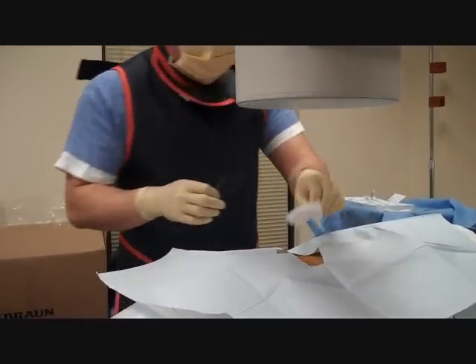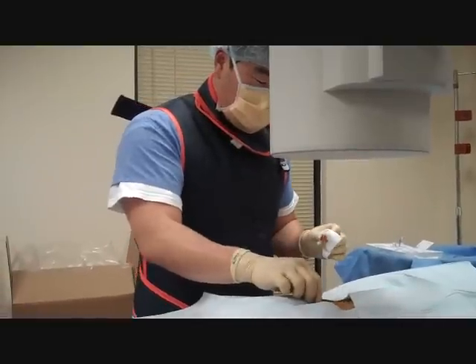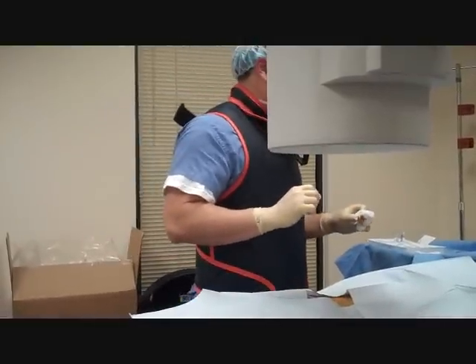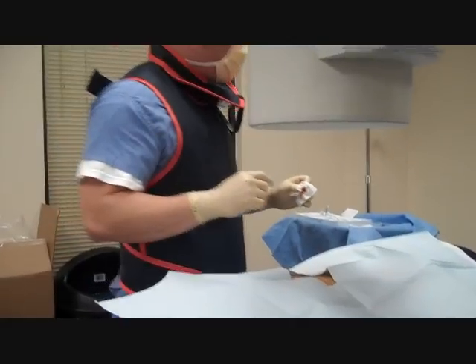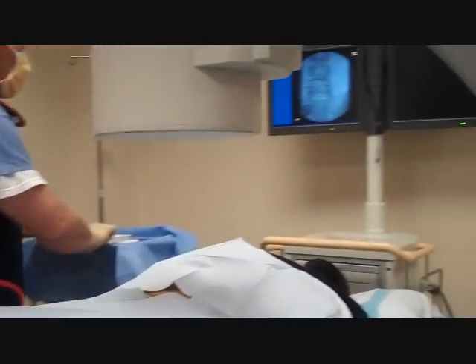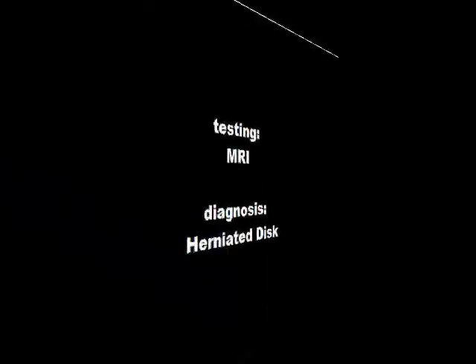Initially, we've cleaned and prepped the whole area sterilely, put a little betadine antiseptic cleaning solution. We can image here, and specifically I'm going to go into the L5S1 inner space, as you can see on the monitor. We have a nice AP view of the lumbar vertebra.